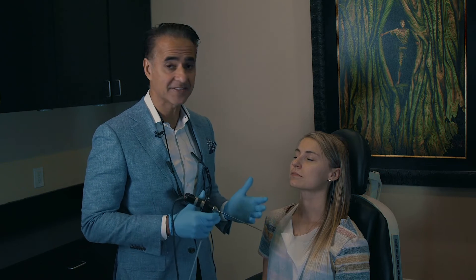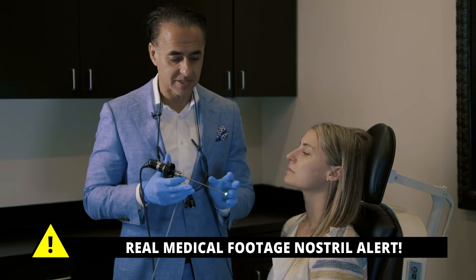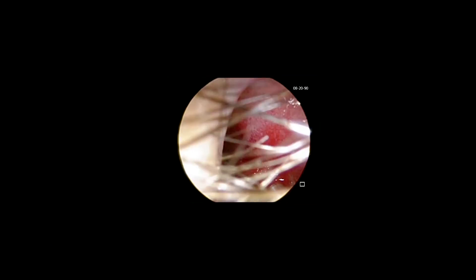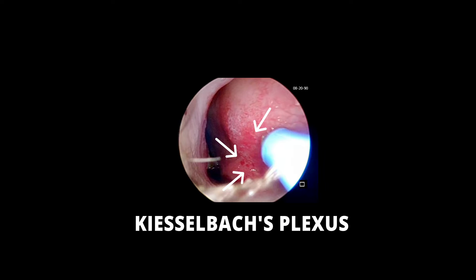After she's all numbed up, the next thing to do is to take a look and find out exactly where she's bleeding from. We're going to use a small scope — this is painless, you can barely feel it as it goes inside the nose. As you can see in the very front, she already has her bleeding points. This is the most common point where people bleed, called Kiesselbach's plexus, which is an area where there are a lot of vessels. This is the area that we need to cauterize.